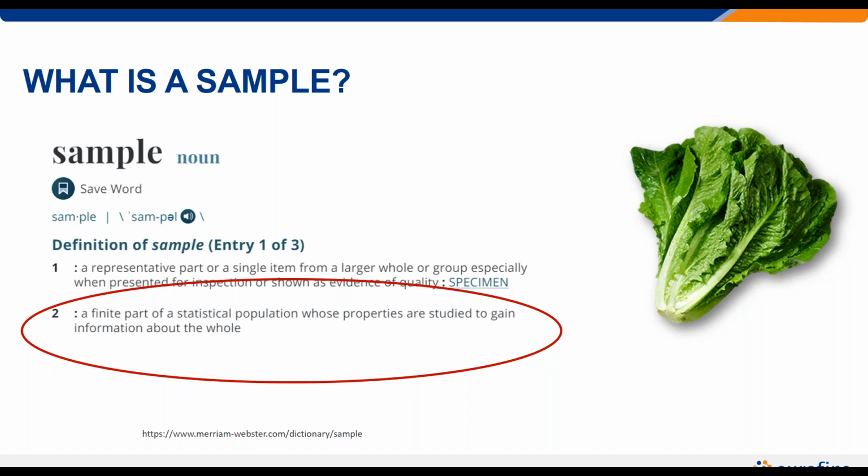And you're probably more likely to find a pathogen on the skin or the hide of the cow. So the thing that's important when you're taking a sample is to design it such that you're successful in getting the result you want to see. So in the case of this romaine, maybe you want to test the tops of the leaves. Maybe that's what your sampler goes and pulls, and then that's reflective of your sample. But the question would be for you, is that reflective of what your consumer may eat? Or maybe it's lower on the romaine. Maybe it's lower on the different ribs or the outer leaves that you may strip off. Or maybe it's at the bottom.